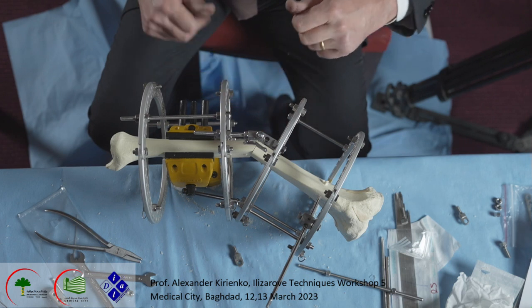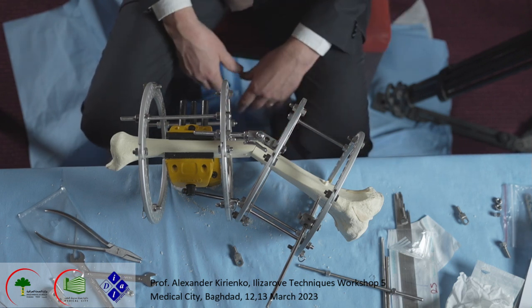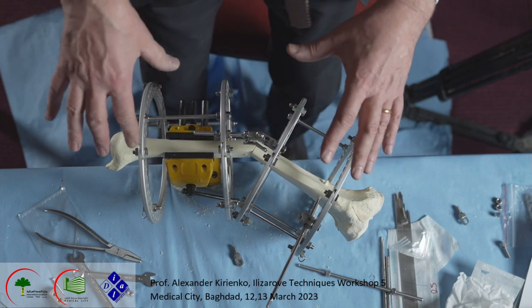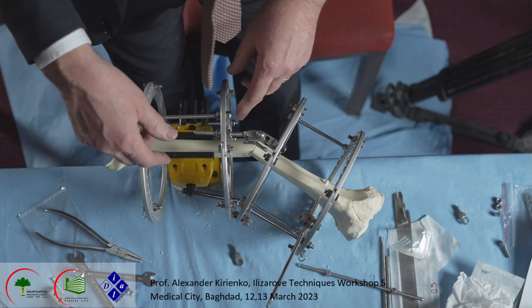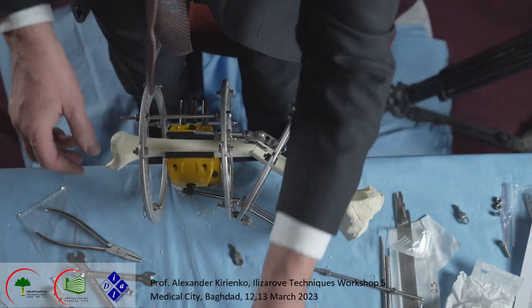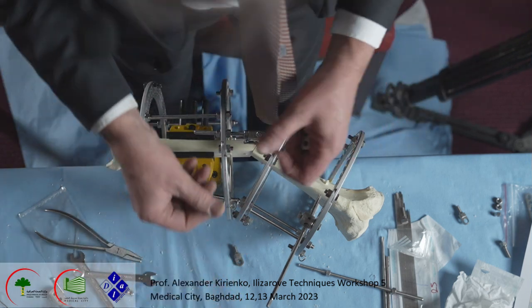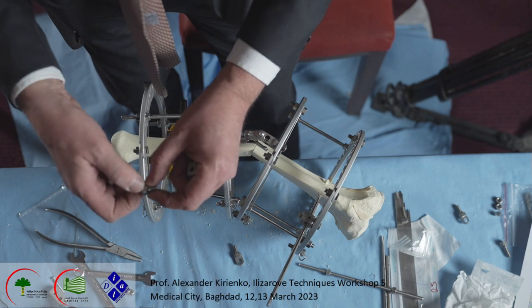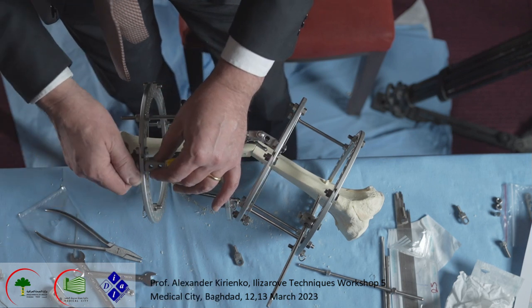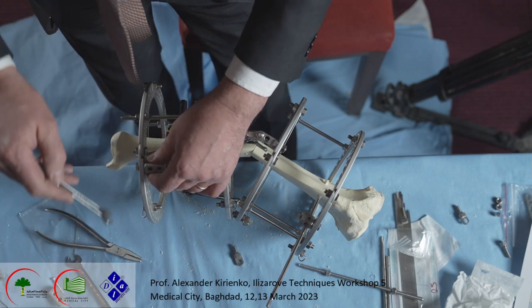And the way when we corrected, this olive touches the bone, and they produce the pushing forces to correct the deformity. After that, what we do, we should reinforce all this system. We put another half pin here, for example. Maybe this small one, yes, it's okay. Half pin here. Sure.